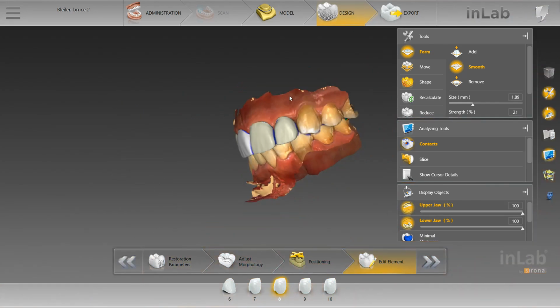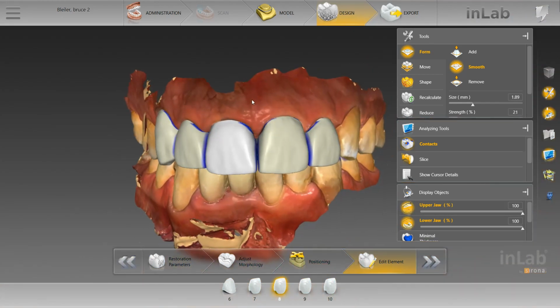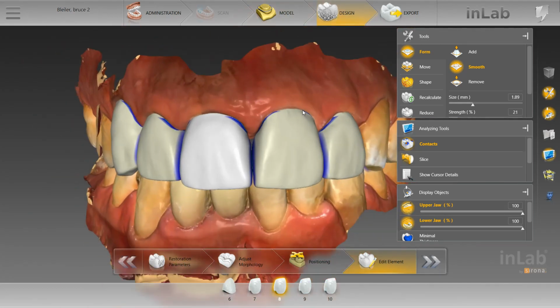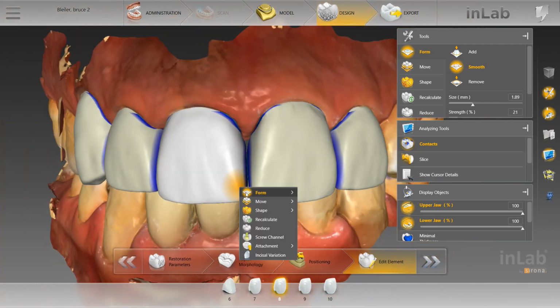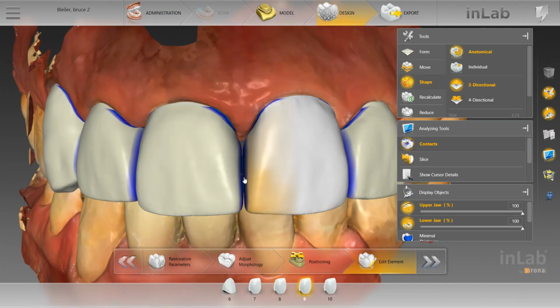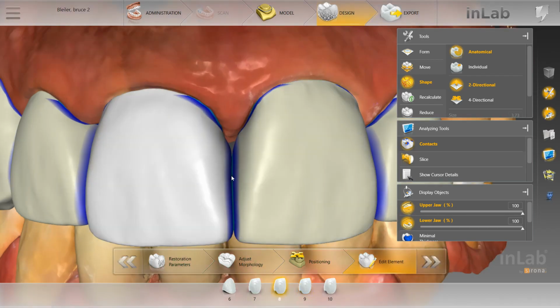Now we'll pull up the upper jaw, evaluate the width, and this isn't a step-by-step technique. This is just a workflow that I use. You take it case by case. So the width of these is pretty symmetric. So we're gonna bring these in on each side, and we'll probably have some contact, but you can see that we're still not perfectly straight. And how we'll fix that is take the 2-directional and go right there. Now we're a little more straight.